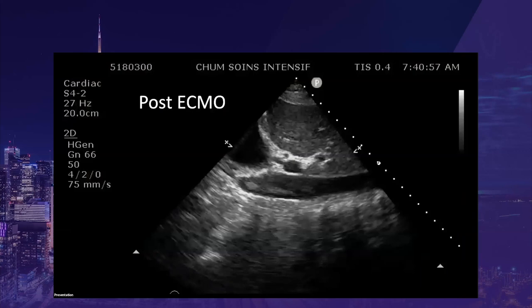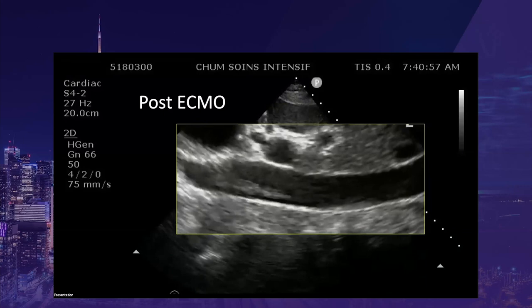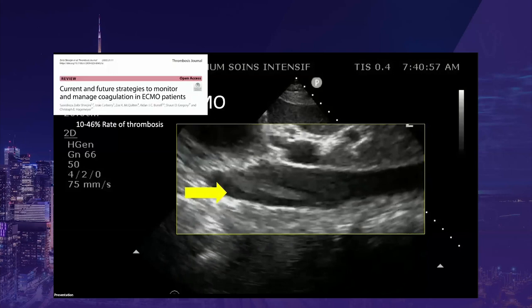IVC imaging can also be useful to identify thrombus, especially in at-risk populations. Here is a large mobile clot seen on surface echography in a patient recently decannulated from ECMO. Up to 46% of patients develop venous thromboembolic complications during or after ECMO therapy. It is important to recognize these complications as they can be devastating.